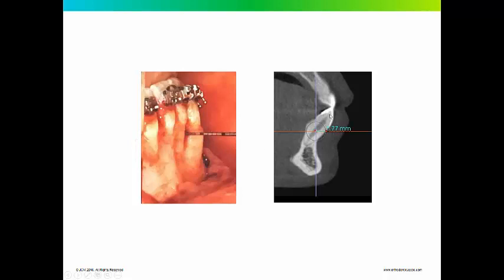It would have been better if I had a pre-treatment cone beam CT, but that didn't exist for this patient. Periodontists use this measurement quite a bit to determine if a graft will be successful. The closer this interseptal bone is to the leading edge or the facial edge of the root of the tooth is a predictor of whether a graft is stable or will last.